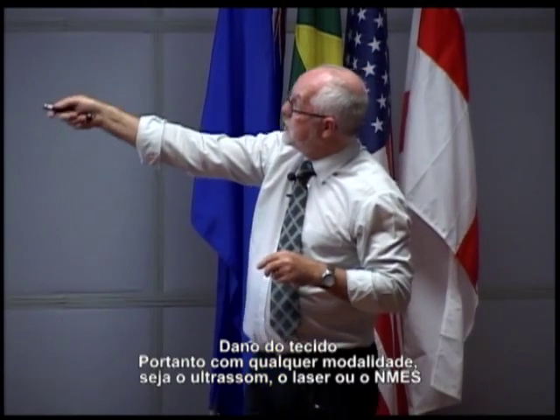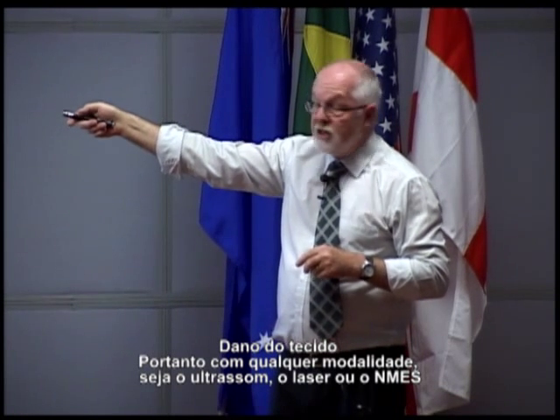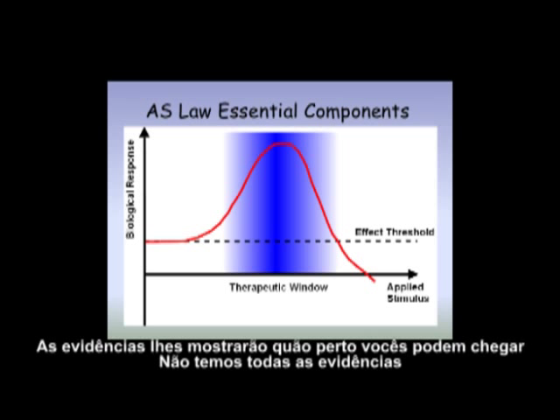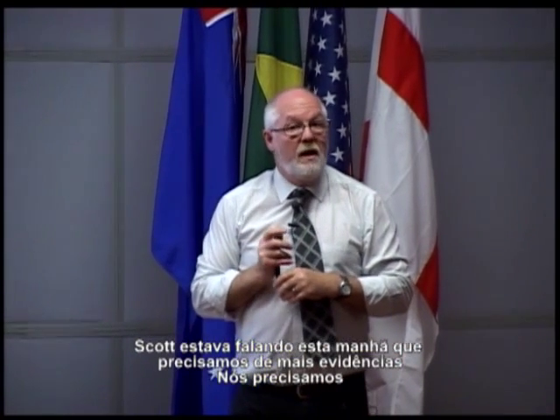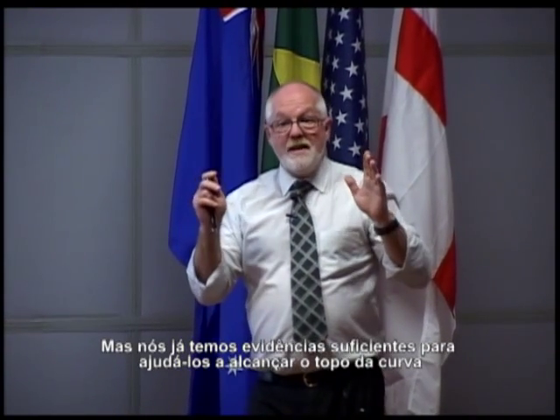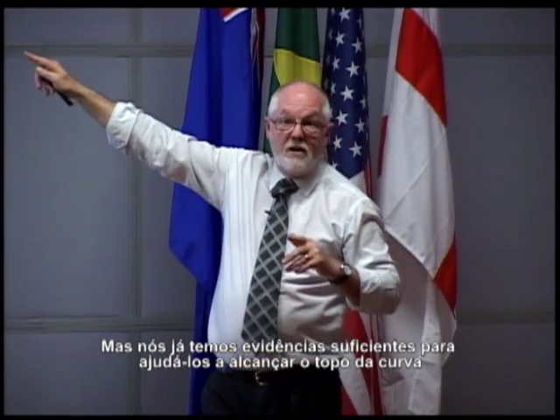So with any modality, whether that's ultrasound or laser or NMES, we are trying to get our therapy dose at the optimum effect. And if you look at the body of evidence, it will tell you how close you can get. We haven't got all the evidence. Scott was talking this morning that we need more evidence. We do, but we already have enough evidence to help you to get to the top of the curve.